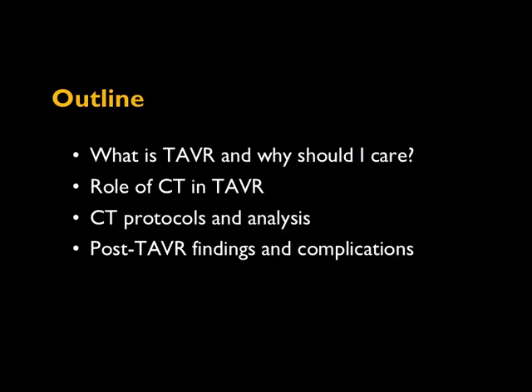So here's an outline of what we're going to review today. First, we're going to talk a little bit about background issues related to TAVR. What is TAVR exactly, and why should you care? Then we're going to talk about how CT plays into TAVR, review some protocols and analysis, and then finally we'll go over some post-TAVR findings and complications.